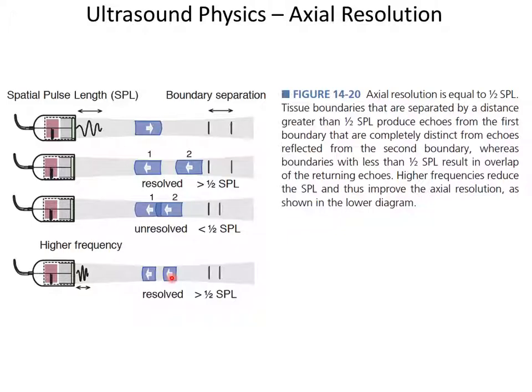About 5 slides ago, there is the major reason we don't go to 80 megahertz. Oh, you could heat up the tissue, that's true. It deposits more energy. And so what happens while it's depositing more energy?